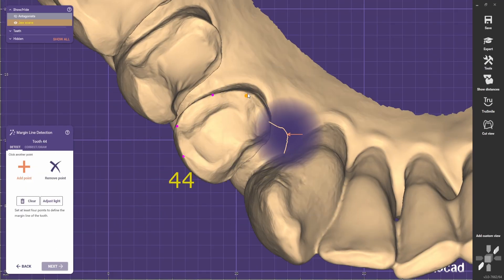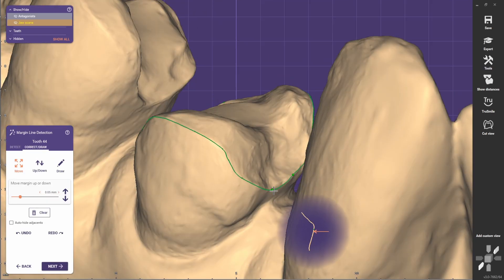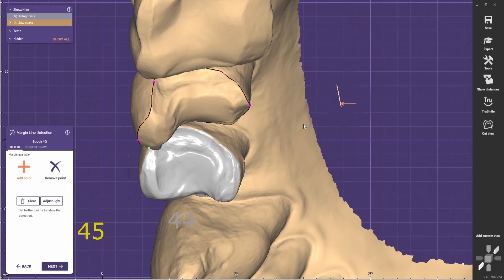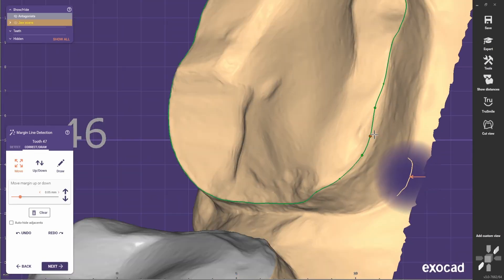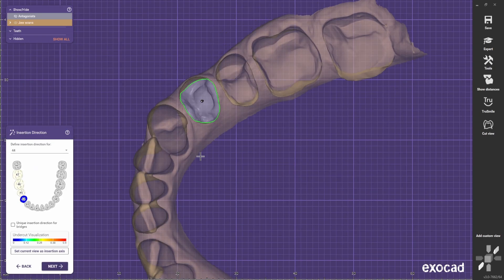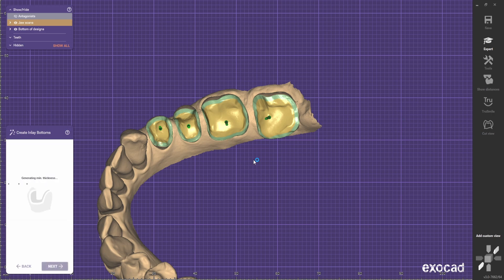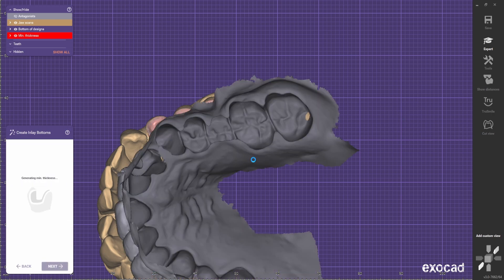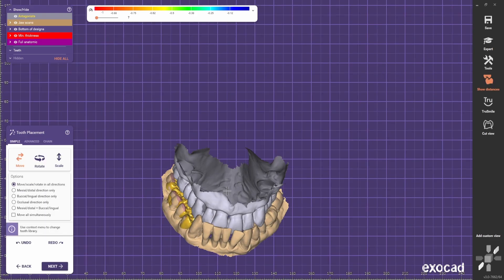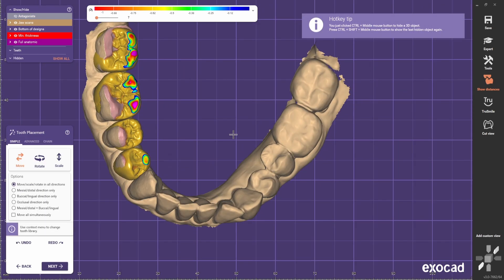For now I'll just set up the margins and I'll be back soon. All the margins are set. Now it's time to place the teeth. In this case we have a crossbite. On the other side we have an onlay there, so the anatomy is not very clear on these teeth. I think we're going to have some fun with this case.